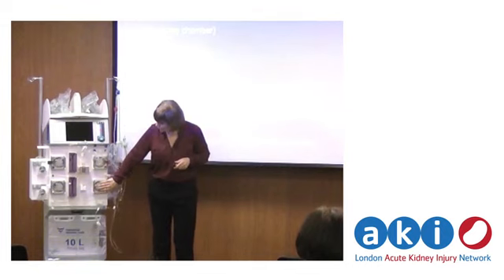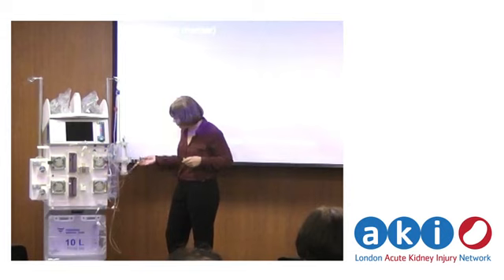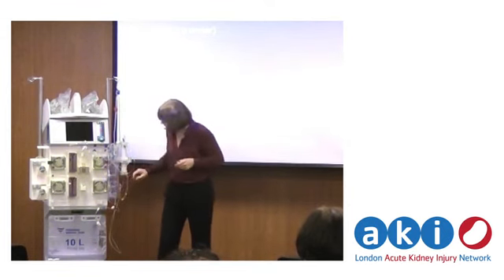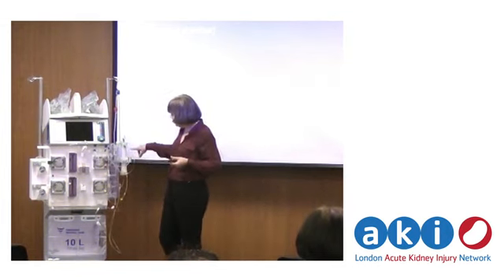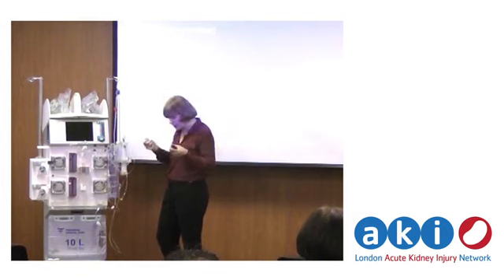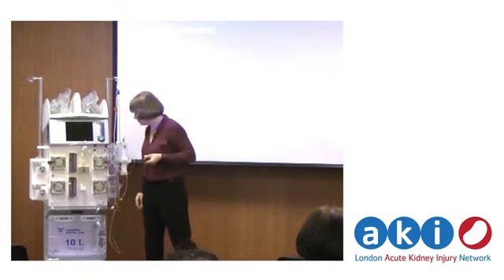This is the effluent or filtrate pump, and this is pulling filtrate or effluent from the outer compartment here and into the waste. And obviously one possible danger, I've never seen it happen, it must be very, very unusual, is that these hollow fibres, the material splits, and if it did that, obviously then you'd be pulling whole blood into the waste, which wouldn't be great.